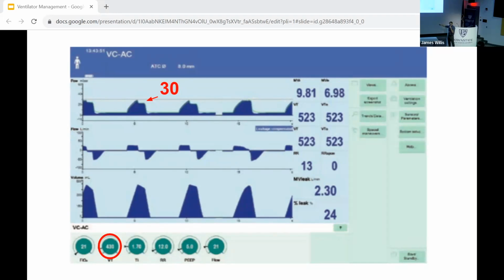We plug in, we have to look at what the patient is giving us back. And that's in the form of the pressures, right? If there's a low lung compliance because both lungs are just taken out by ARDS, the pressures will tend to go high. So how did we get this? Like we said earlier, we did a brief inspiratory hold and we generated a plateau pressure. And one of our targets is we want that number less than 30. Like we just said, once it goes above 30, mortality goes up. So we want that number less than 30. So tidal volume is important.